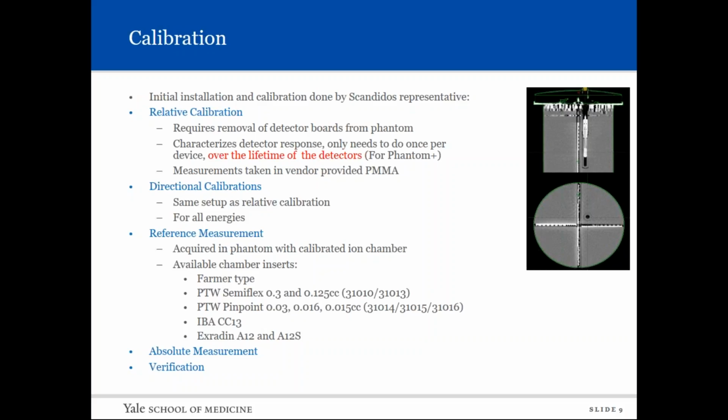The reference and absolute calibration, and this cavity fits several different common ion chambers, a Farmer chamber, and many other models.